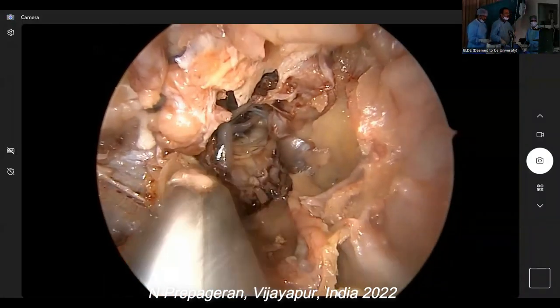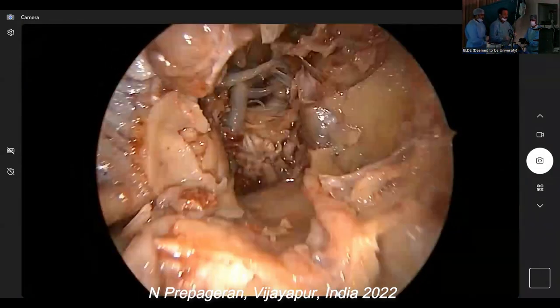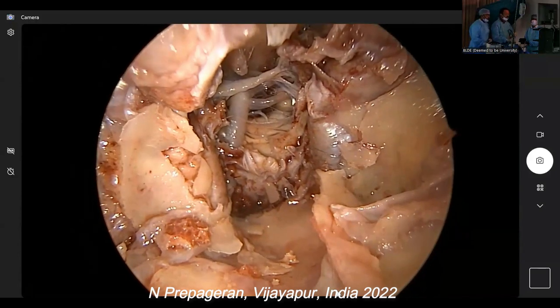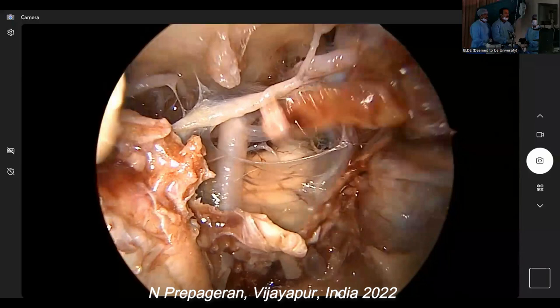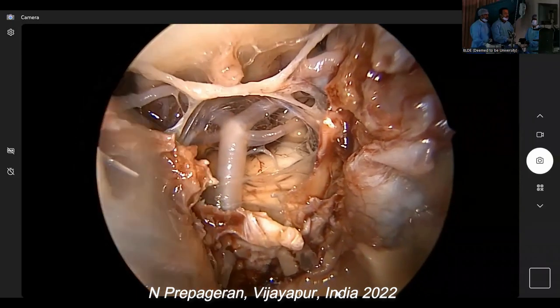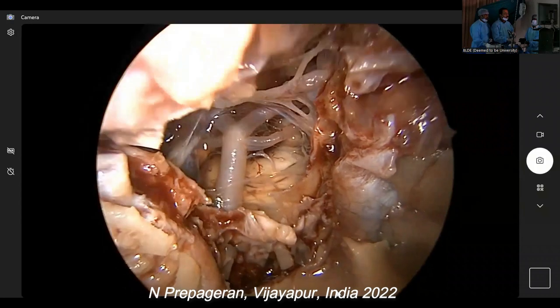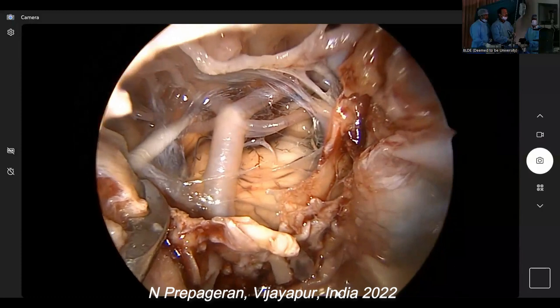Okay, good. That should be good enough. At least you can see one side. Yes, sir. Sickle knife. I need a 30-degree scope after this, and a ball probe. So what we're going to do now, okay, so now we are going to see, okay, good. Yeah. Basilar artery.